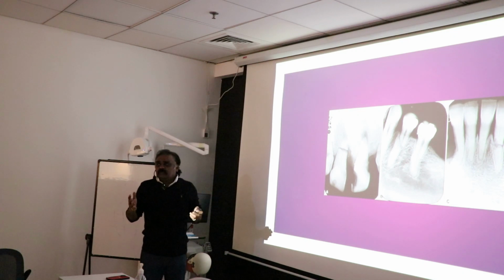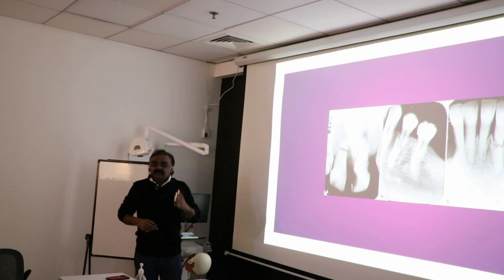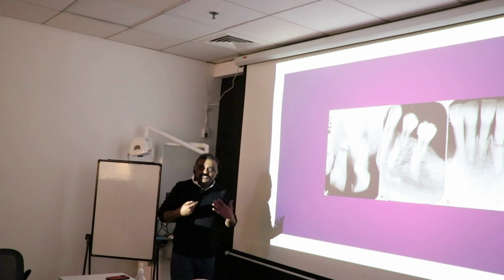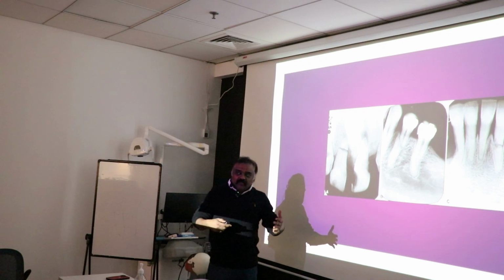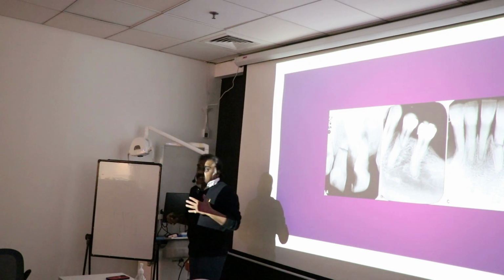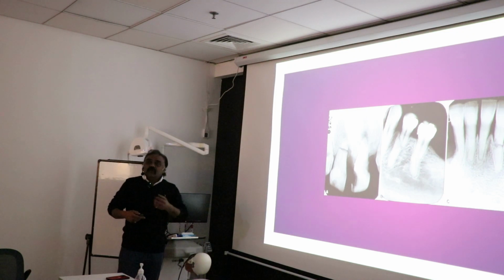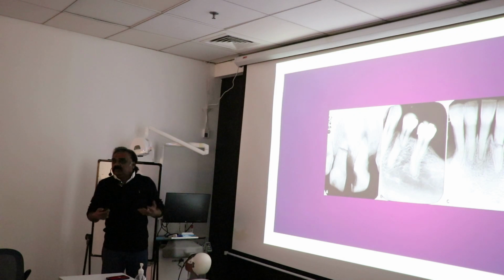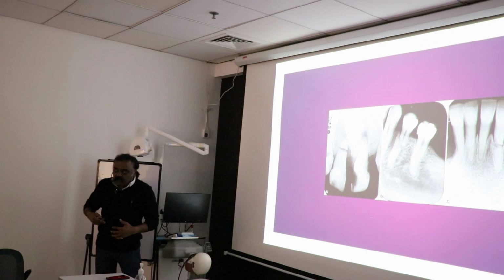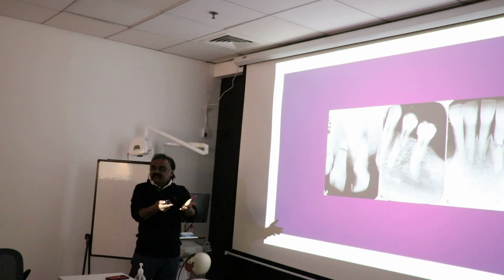There are various ways of doing it. Of course, the conventional way was done here, where you have the braces given. Because when we have situations in our clinic, a patient has come to you for the replacement of implants, or rather the replacement of lost teeth in the anterior section for the purpose of aesthetics. Many of them would not like to hear the words, okay, go ahead, wear braces for the sake of your own improvement, so that we are able to extrude the tooth, bring the bone along with it, get the soft tissue to the right contour, and then I remove the tooth and replace it with an implant.